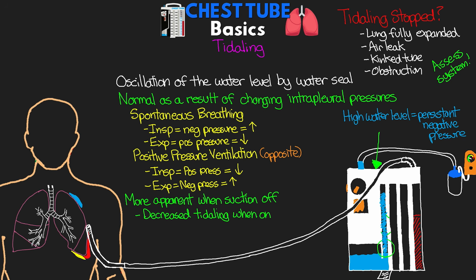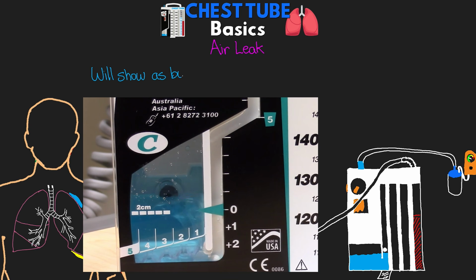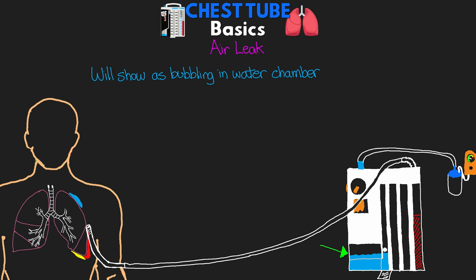And then the next thing I want to talk about is another very important thing, and this is actually going to be air leak. An air leak is going to be shown as bubbling in the water sealed chamber. And so we actually have marks down there that help to quantify how much air leak is taking place. Typically they're marked anywhere from 1 to 5, and the higher the number, the more bubbling and the more of an air leak that you have.